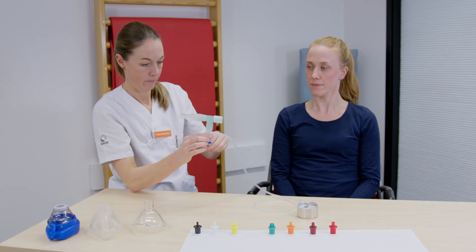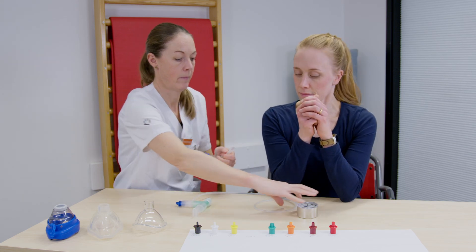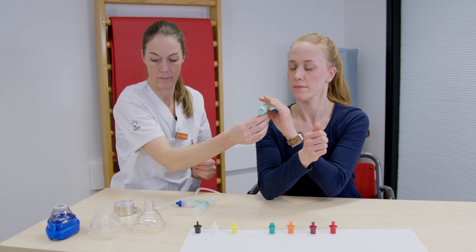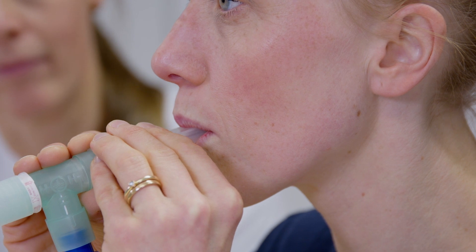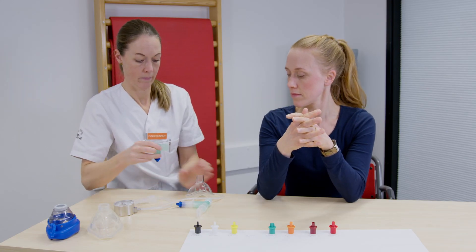Patienten ska helst sitta upprätt med fötterna i golvet och stöd för armbågarna, exempelvis mot ett bord. Fysioterapeuten kontrollerar att läpparna sluter tätt runt munstycke, eller att masken sluter tätt mot ansiktet.